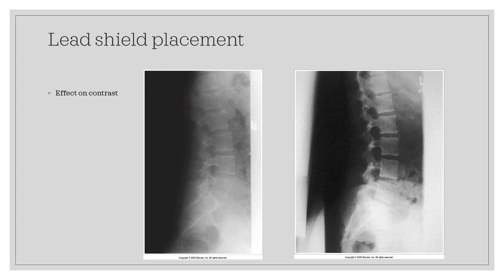Lead shield placement and the effect on contrast. So the first image, the lead strip was not placed, and you can see it could use some better image contrast. The second image was placed with a lead strip behind the patient, as you can see on the image, and it is much better. It cleans up the scatter.